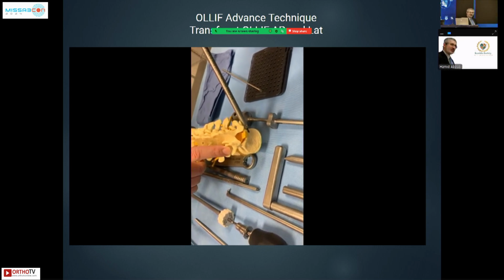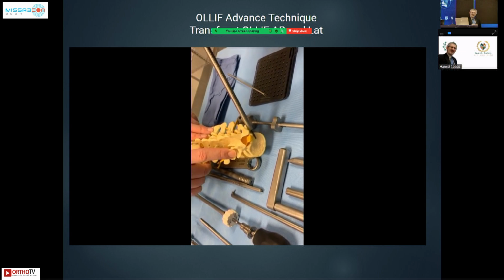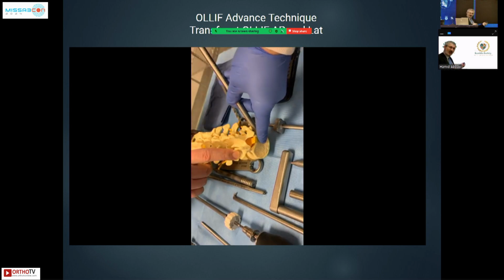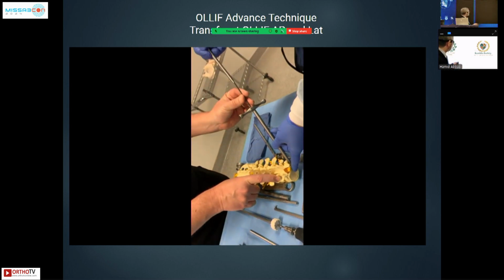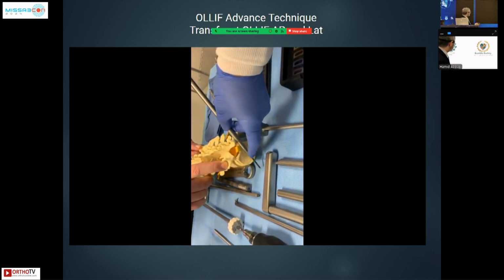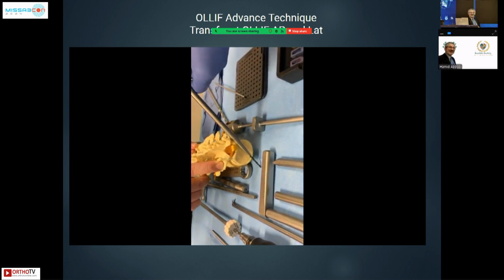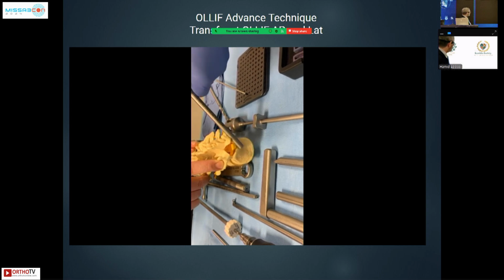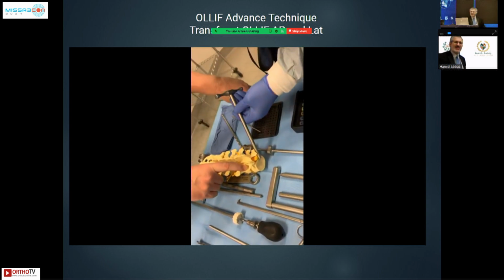And Varun, this is one of the next things I'm going to bring you next time I come here, because these are very easy steps, and it's all cannulated: a small drill, big drill, and then the tube follows. And then once you are there, the rest of the surgery is the same. Obviously you don't want that to happen in the actual surgery, but it won't, because there's tissue holding it back. But for demonstration purposes, let's look at actual X-rays.